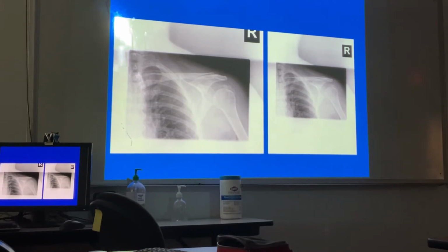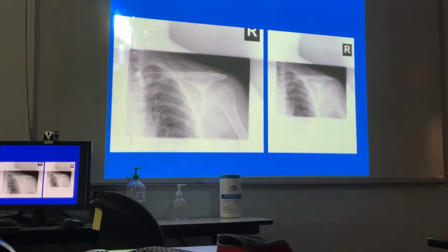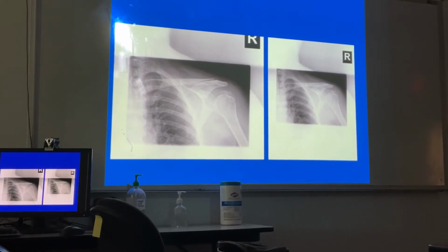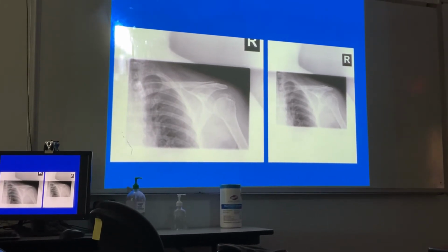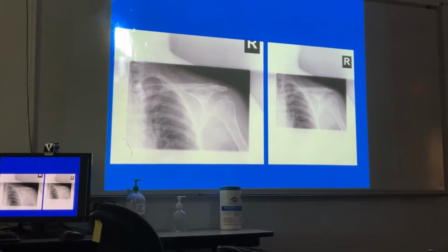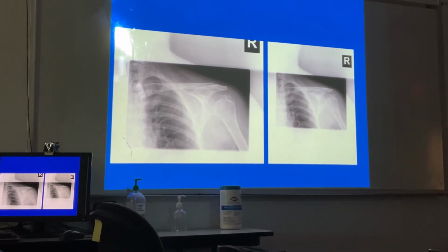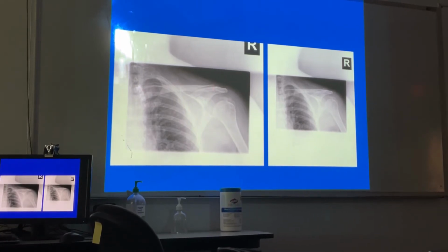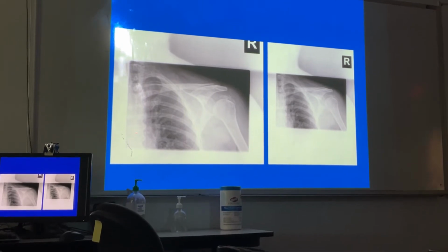Okay? Tendinous calcification, again, is calcification where there shouldn't be calcification, most commonly in the rotator cuff of the shoulder. All right? Is that an AP shoulder? Yes, both internal rotation. Okay? Now, the reason we do landscape is why? So that I can see the glenohumeral joint, the acromioclavicular joint, and sternoclavicular joint, and mid-thoracic, like in this case, the manubrium.